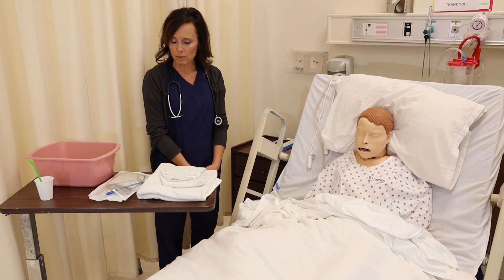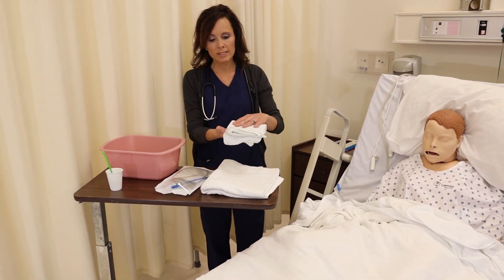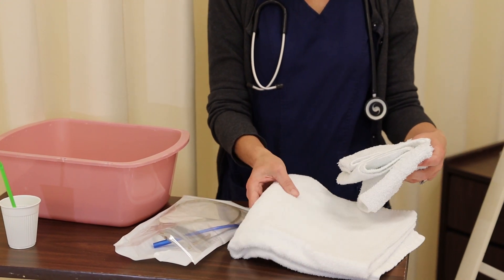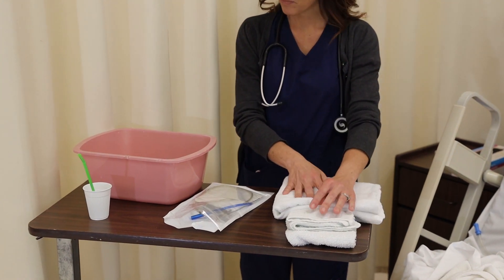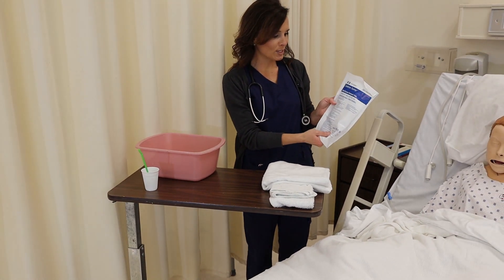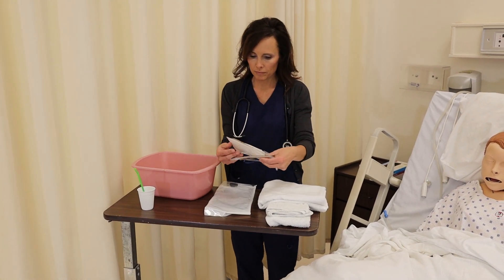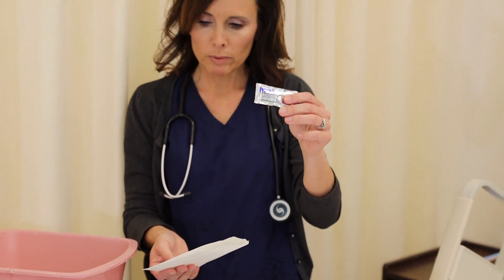Next we're going to gather our equipment. I'm going to show you your equipment here. We're going to get some washcloths — this can be a little bit uncomfortable for the patient; they may begin to tear up and cough, so you might want to get some washcloths handy. Our towel we will drape across them to protect their gown and their bed. Of course our NG tube as well — 14 French. Inside of your package you're going to have your NG tube, and you should have some water-soluble lubricant we will use as well.